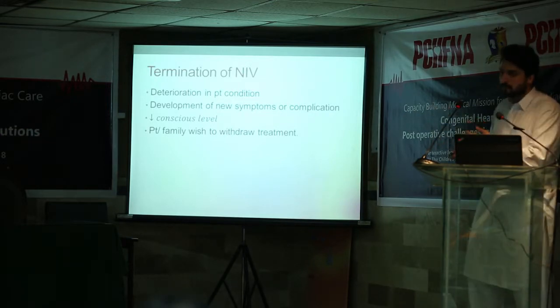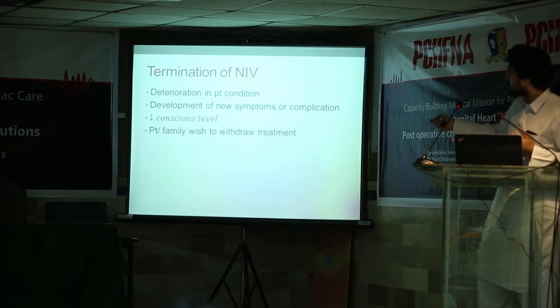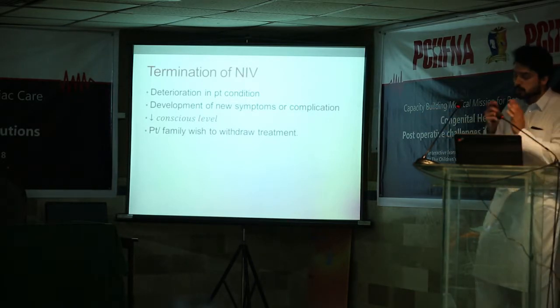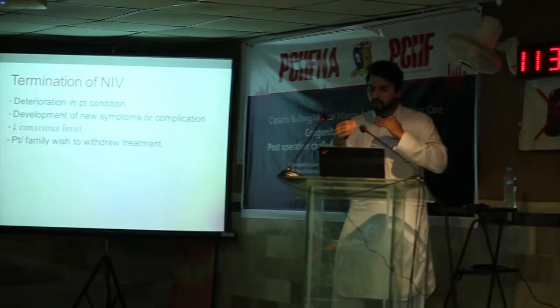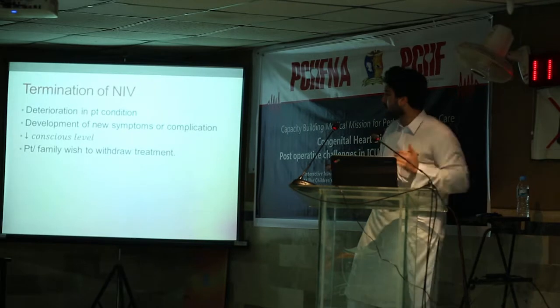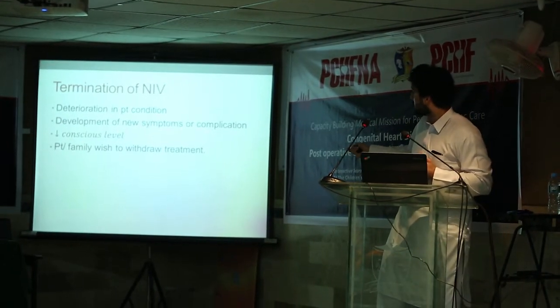So, termination of NIV. Everything that starts, you should stop or end it. So, this is termination, this is when to stop it. If there is deterioration in the patient's situation, the patient is getting worse and worse after the NIV, we should stop it. Consciousness is coming down, development of symptoms or complications.